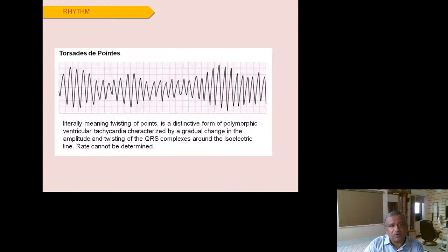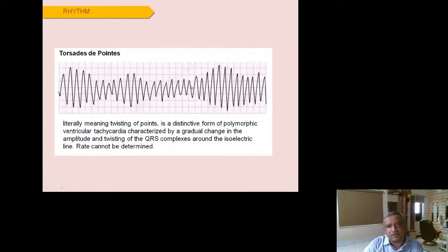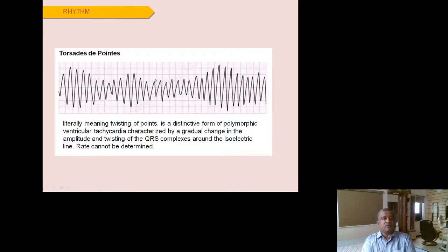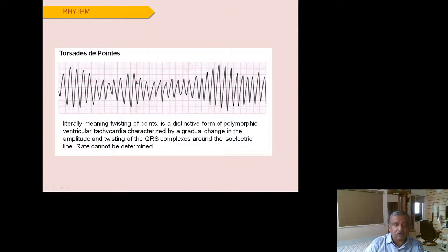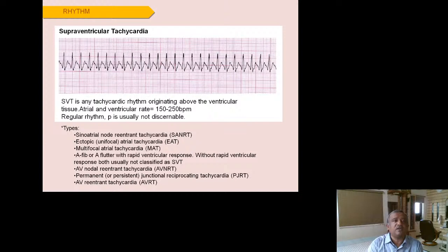Torsades de pointes means 'twisting of points' — a polymorphic VT characterized by a gradual change in amplitude forming a spindle or dumbbell-like figure. It can occur with prolonged QT syndrome or after certain drugs that prolong the QT interval, which is why measuring the QT interval on ECG is important. Treatment is DC shock whenever the patient is hemodynamically unstable.